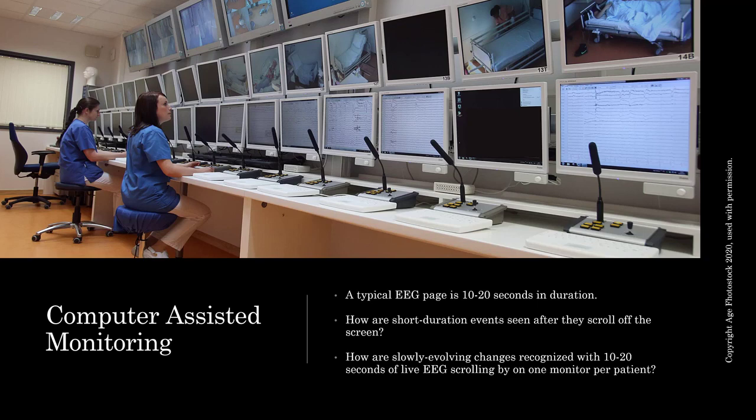Now, before we go into the details of various detection technologies and trends and how they work, let's have a look at some of the issues that we're trying to help with, some of the problems we're trying to solve, and some of the ways that we can maybe get a better view of what's happening with the patients.